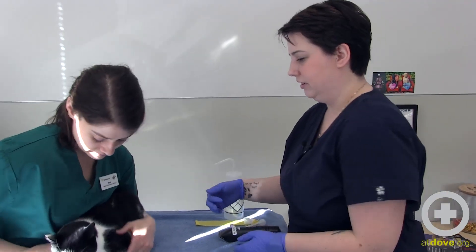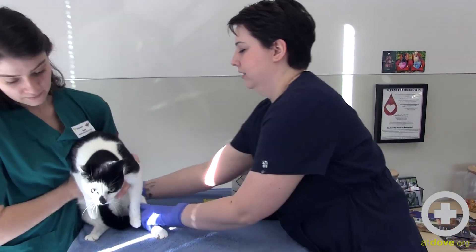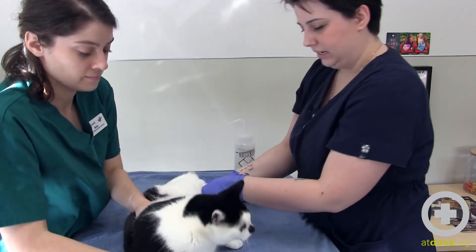We are going to be drawing from her medial saphenous vein to get a PCV. So Katie is going to hold her and put her in lateral recumbency.